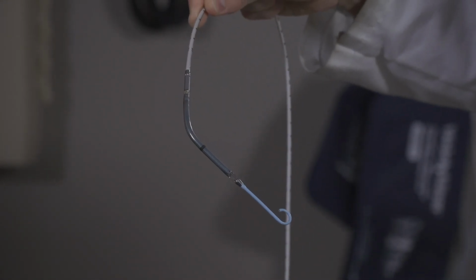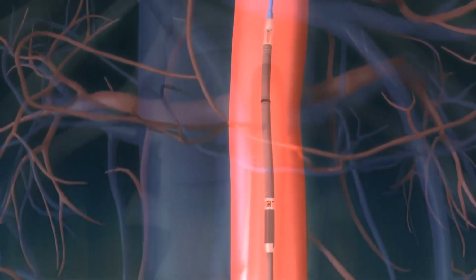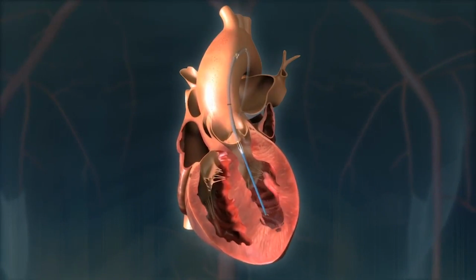But Temple University doctors are establishing protocol for a new device called the Impella pump. The device allows us to let the heart rest as opposed to flogging it, therefore allowing the best chance of recovery after the balloon and the stent are performed. The tiny Impella pump is temporarily inserted through the groin to stabilize blood flow, giving the interventional cardiologist time to deploy the permanent stent to keep the artery open.